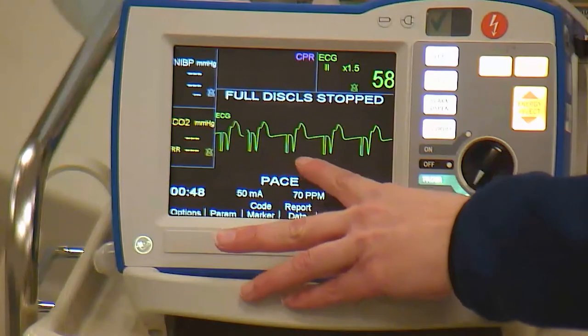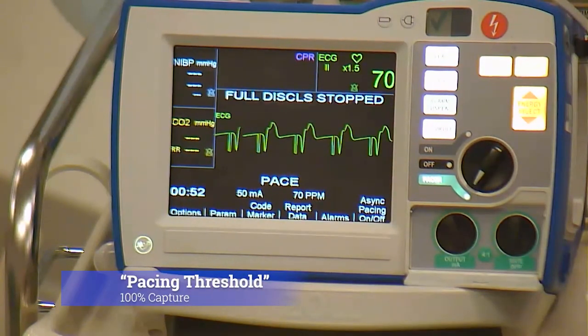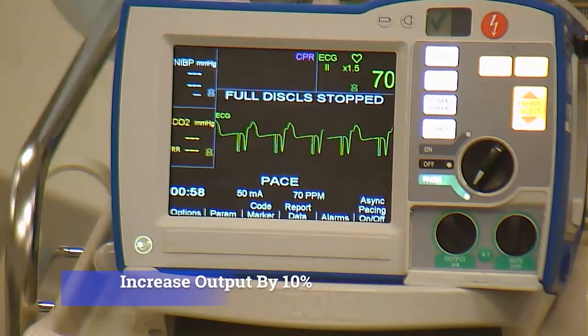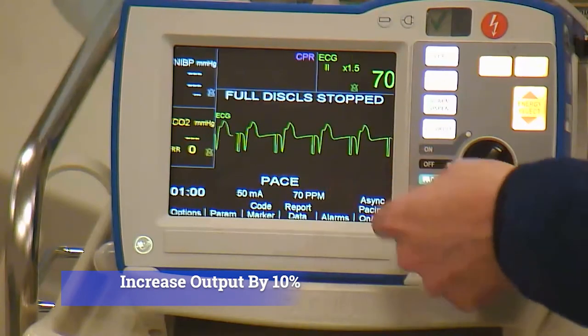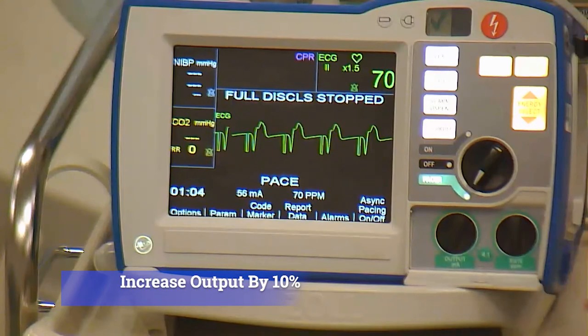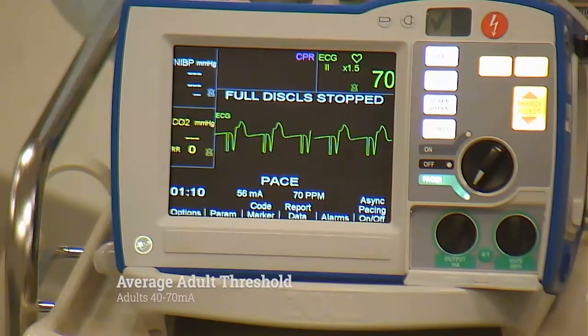You'll see pacer spike, QRS, pacer spike, QRS. Once you get 100% capture, this is your pacing threshold — you're going to want to increase your output by 10%. It only increases by increments of 2. The usual threshold for an adult is 40 to 70 milliamps.